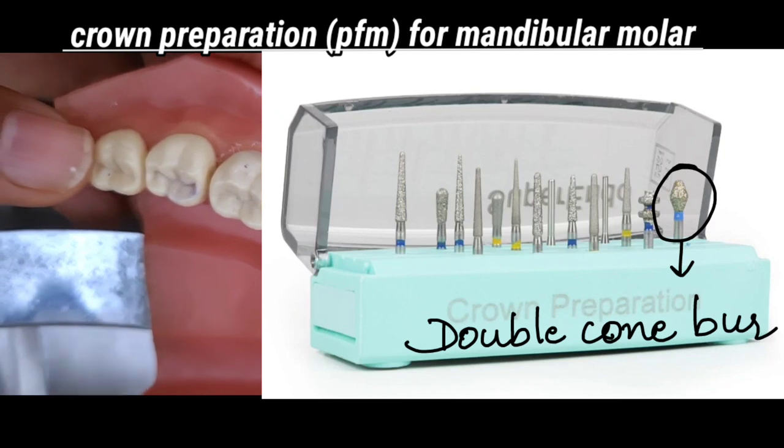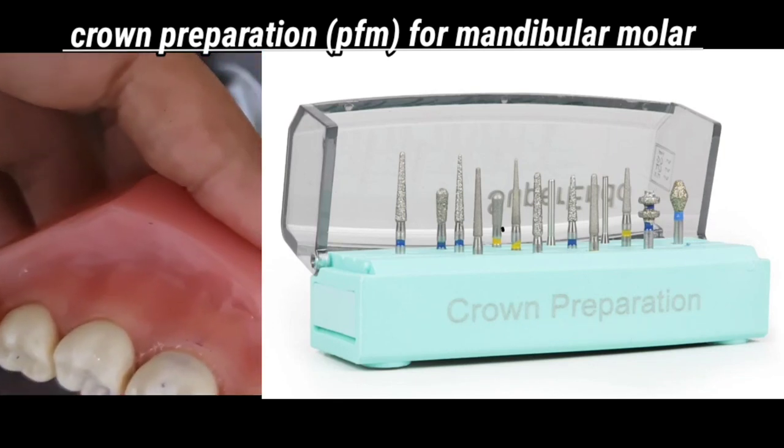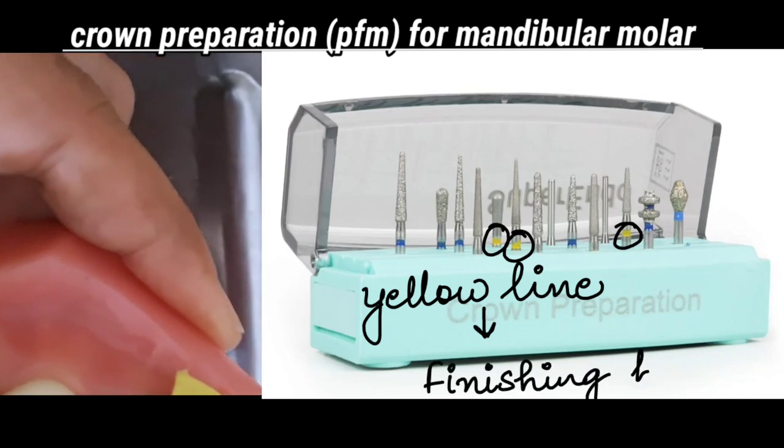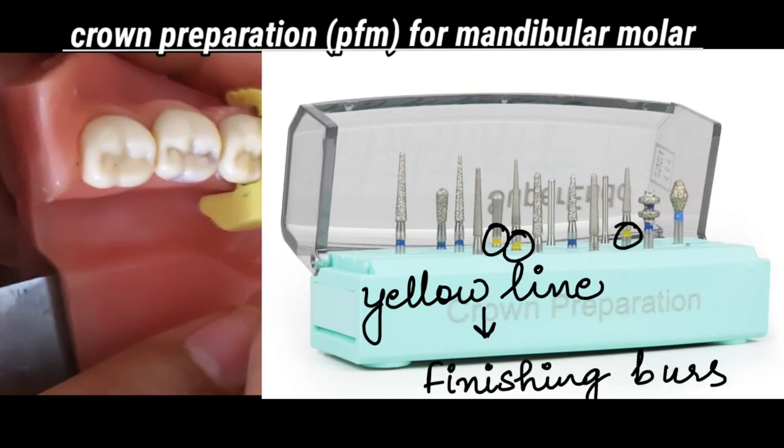In this burr kit, we have these color coding burrs. So the yellow line burrs in this burr kit are used for finishing and polishing the tooth preparation.